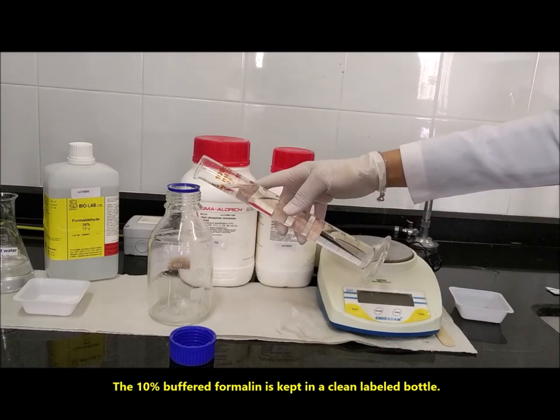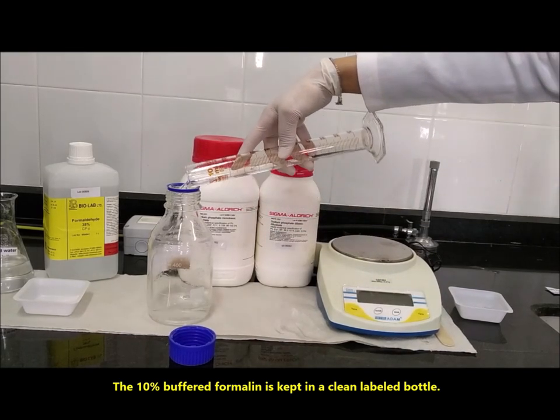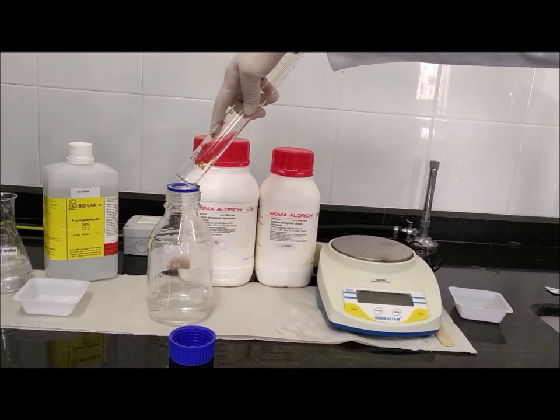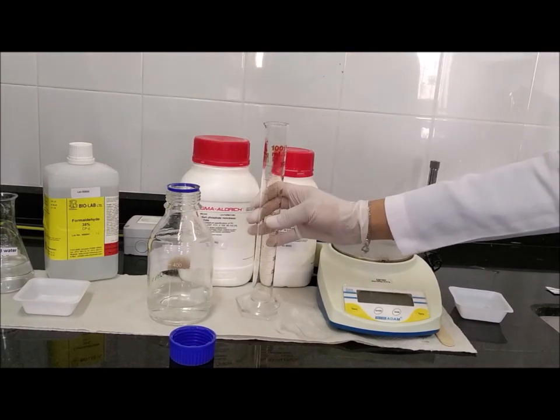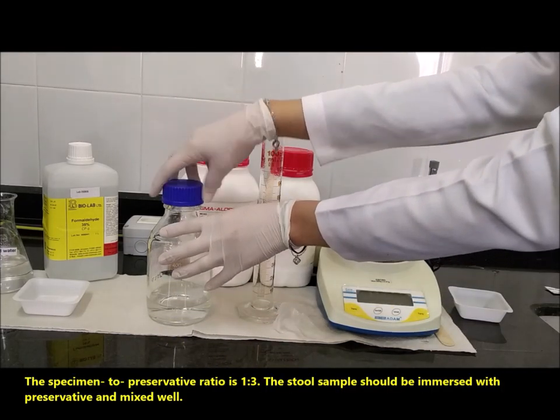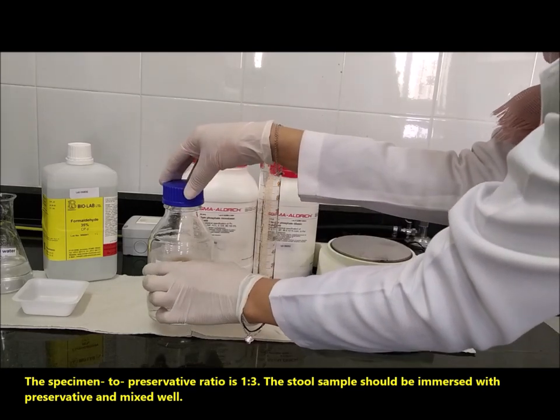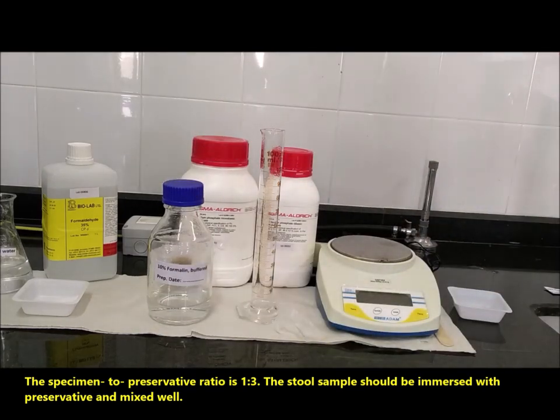The 10% buffered formalin is kept in a clean, labeled bottle. The specimen to preservative ratio is 1 to 3. The stool sample should be immersed in the preservative and mixed well.